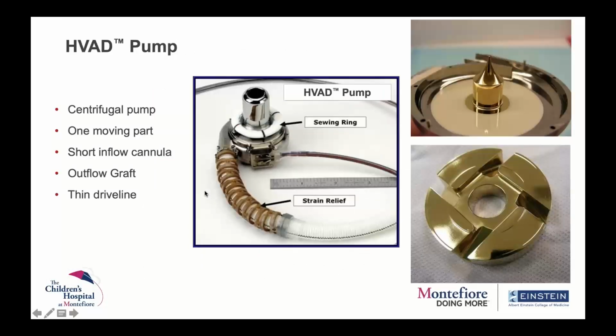Again, looking at this pump closely. So you have the actual pump, you have this cannula that sits inside the heart, and this machine has one moving part. Again, these are two magnets. Over here on the right, you can see these are two magnets, so it's magnetically levitated. Using the magnetic force, the rotor moves.